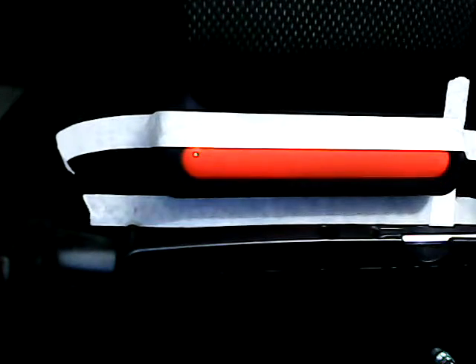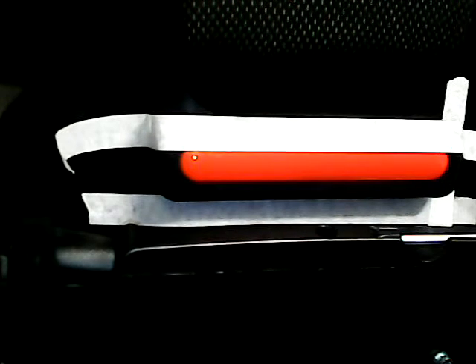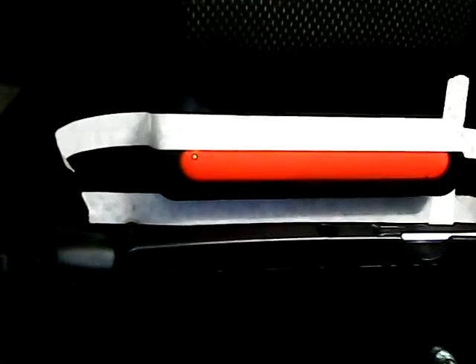There we go. Okay, so I'll be leaving that to sit there, and the little instructions on the back of the dispensing tube, I pulled away to vent for the 2 minutes I talked about, and it needs the materials pressed firmly together for 10 minutes. So I will follow that, and then it takes between 24 hours and 72 hours to cure, between 1 and 3 days. We're now in the Canadian fall weather. Temperatures are just above freezing, and I'm certainly not going to expose my wheelchair to the cold weather, at least for the first 24 hours.